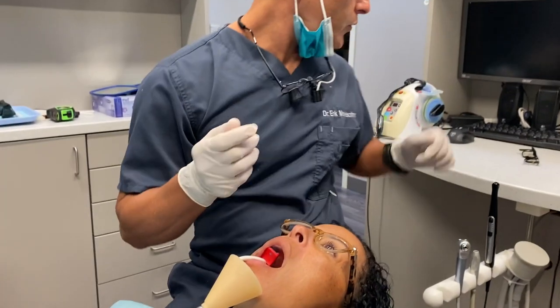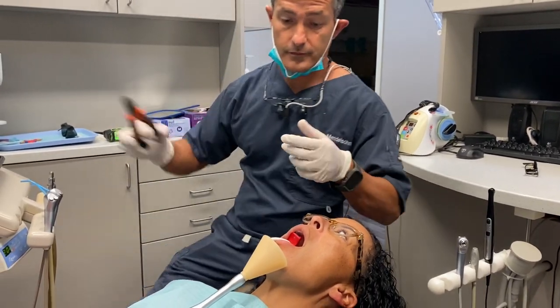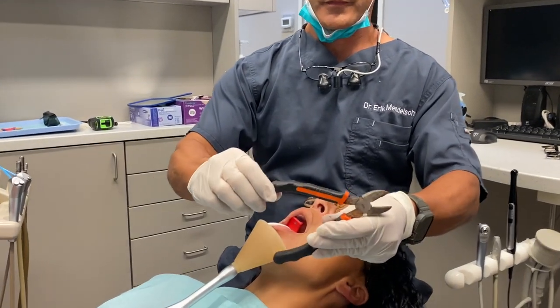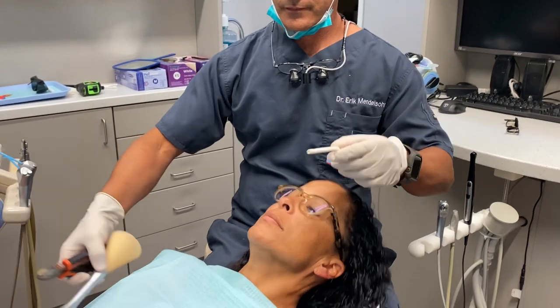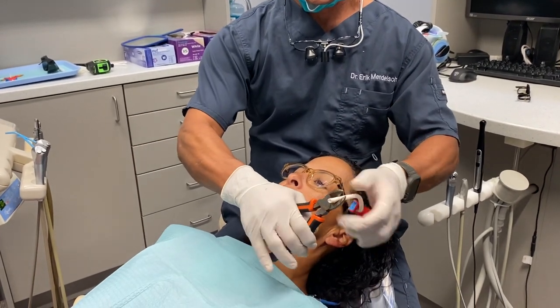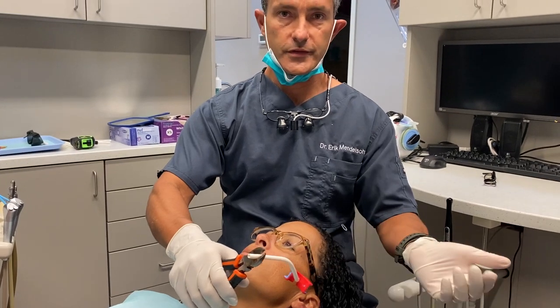And if you decide you want to pre-cut them yourself, you can use a standard wire cutter and cut to any length you want. Now we have them pre-cut, or you can just do it yourself — whatever you prefer.